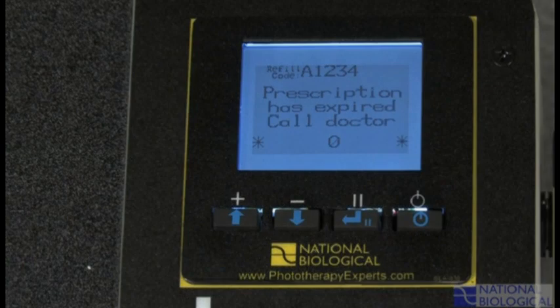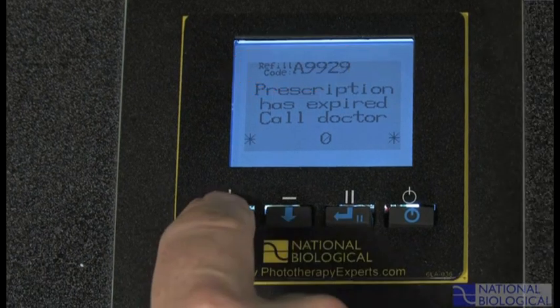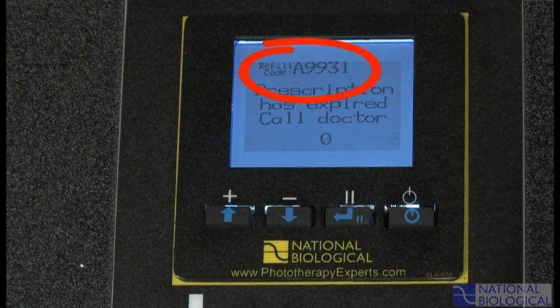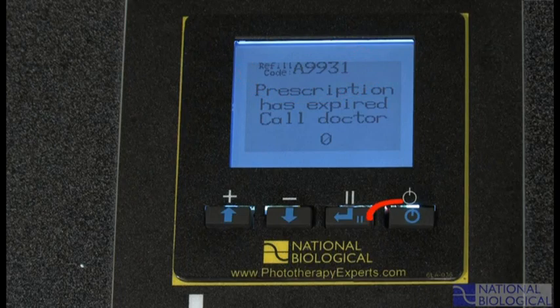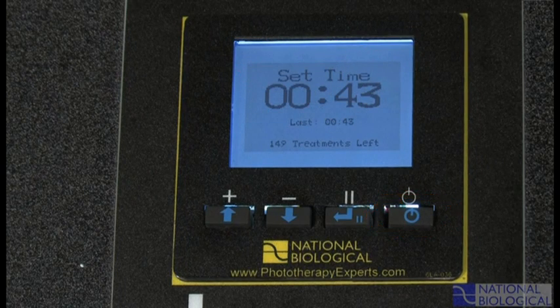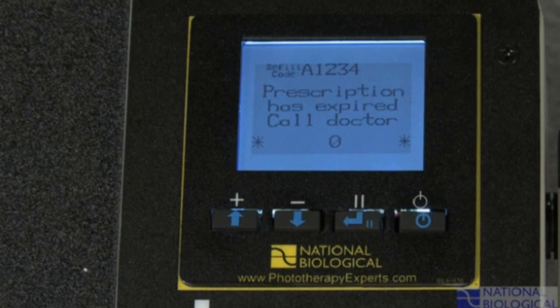When you call your doctor for more treatments, you'll need to provide the expiring refill code found at the top of the call doctor screen. From the call doctor screen, use the up and down arrows until the new refill code is displayed, then press on. The set time screen should display. If you still see a call doctor or expired prescription screen, check that the refill code entered was correct. If you still have trouble, contact your doctor to have your refill code verified or to have another refill code issued.